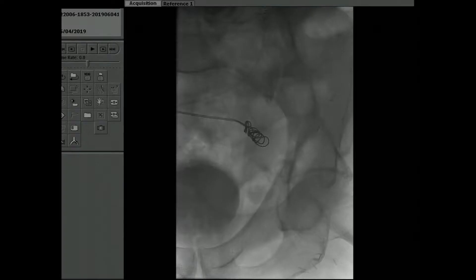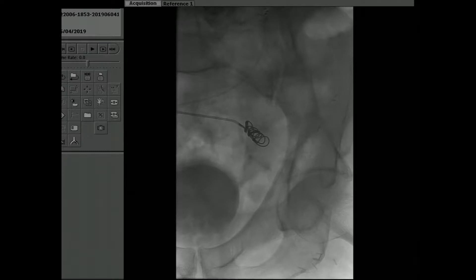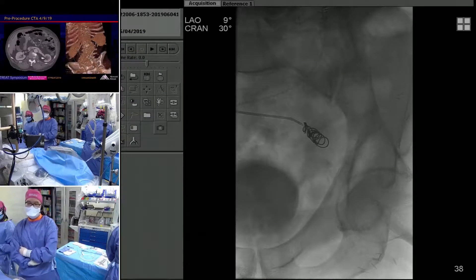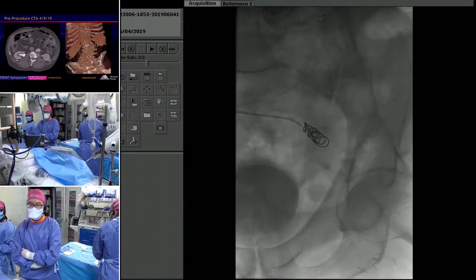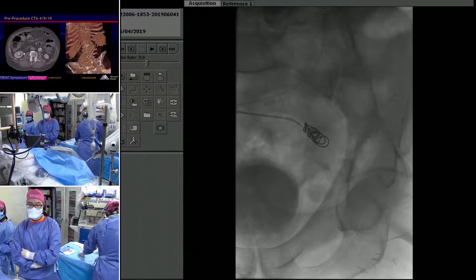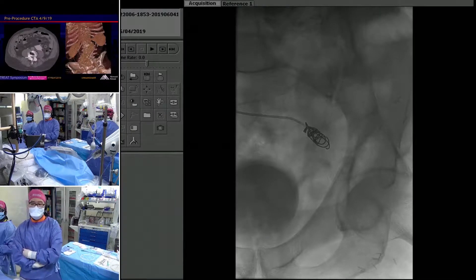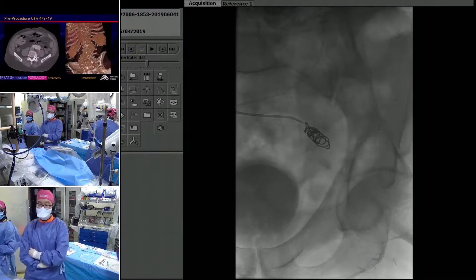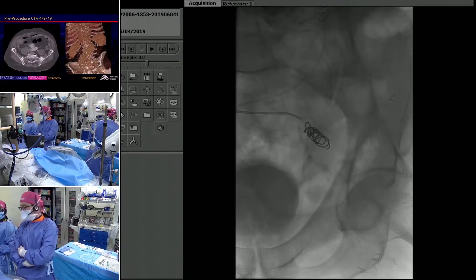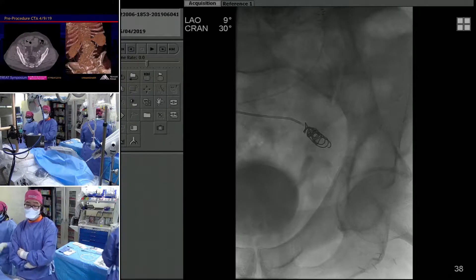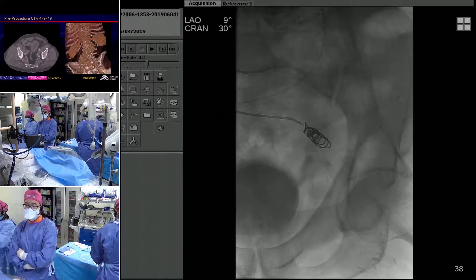The size we chose is an 8. The main internal iliac branch right before it bifurcates goes down to about 10 millimeters or slightly less. The sub-branches are much smaller, about 5 millimeters. As we discussed, we'll use a fully detachable coil all the way here and then try to coil this all the way out.